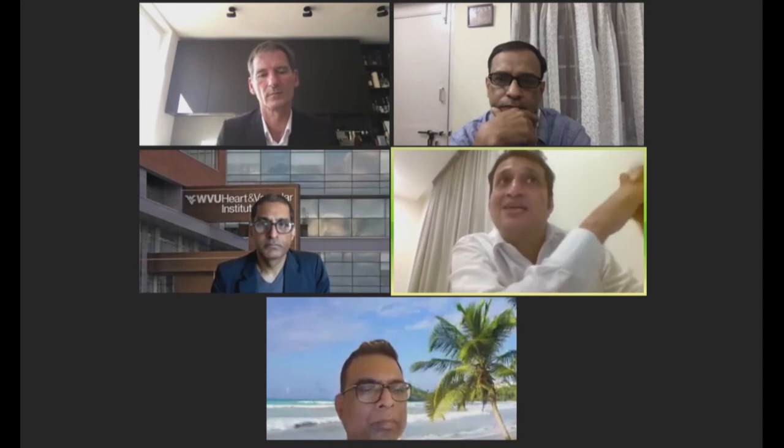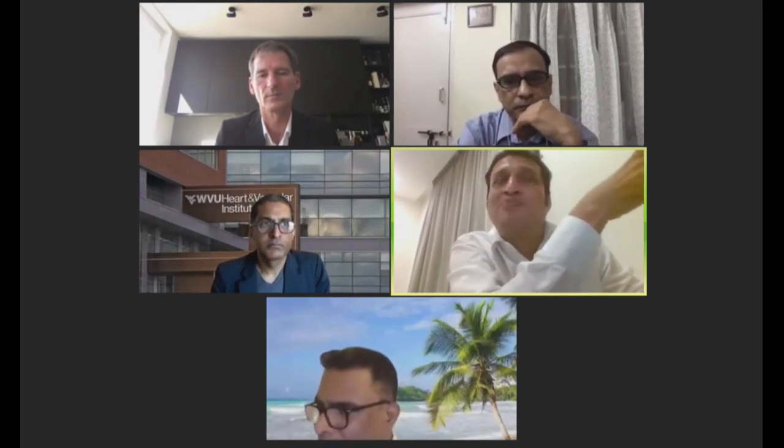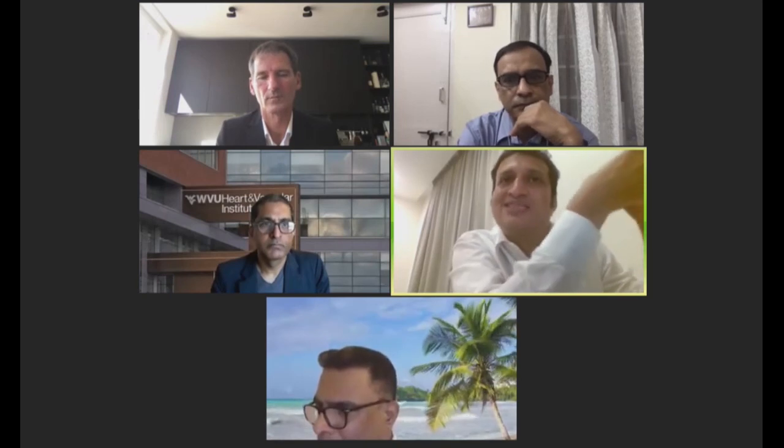Thank you, Dr. Carsten. I think you summarized it very well. So in a device like this, where there are two ways of protection, I think it makes sense. Most of the time when we take ACP Amulet, I think we are more worried about the lobule or the umbrella and not on the disc, because there the disc is just pure secondary protection. Your primary protection actually comes from the lobule. But when you talk about a device like Lambre, it is the disc, it's a partially covered disc. It's probably more protective. And even if you have multiple lobes, the purpose of your umbrella is just to anchor the disc so that the disc sits right. So it's very well put.